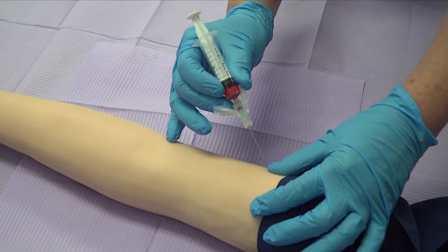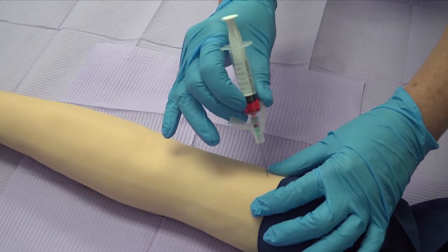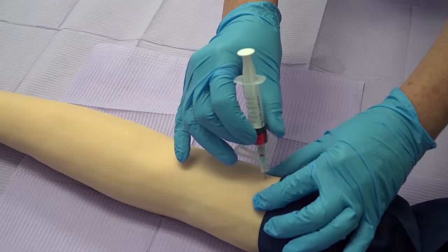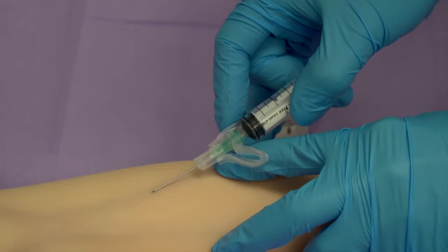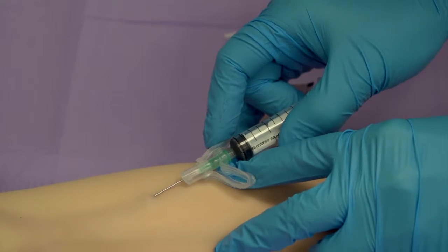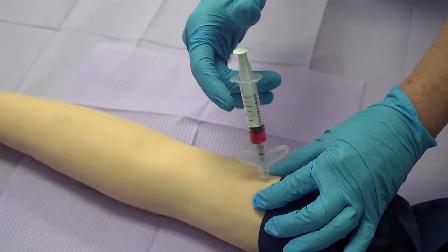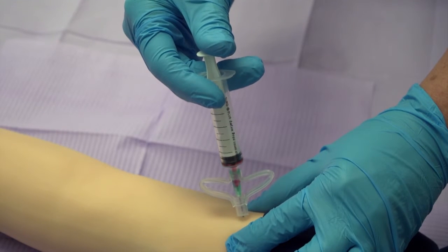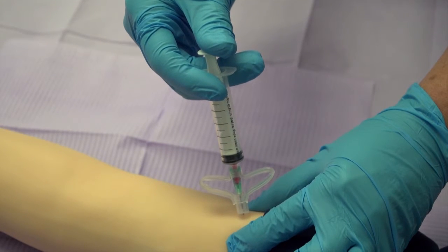Perform the intended clinical procedure while releasing your hold on the silicone spring sleeve as soon as the needle tip is in the intended position for the specific clinical procedure — be it within the muscle when performing an intramuscular injection, or within the lumen of the vein when performing a phlebotomy procedure. Releasing your hold of the silicone sleeve will allow the passive safety mechanism to become available. It is thus key to release the finger hold on the silicone sleeve at the appropriate stage during the clinical procedure. Withdraw the needle.